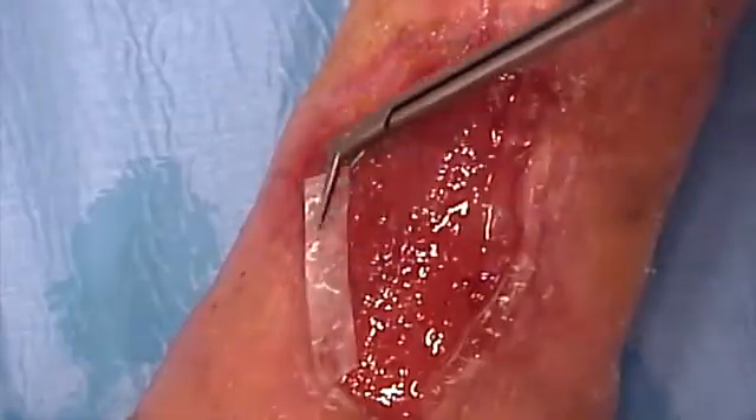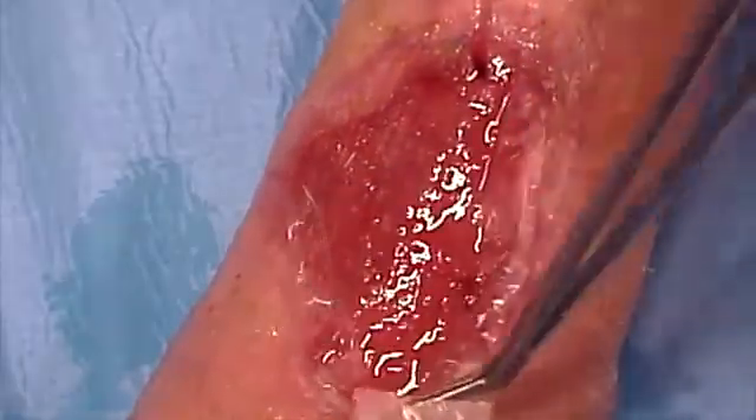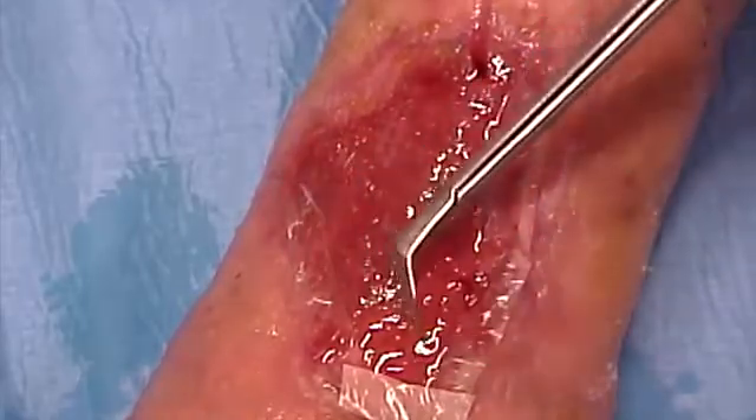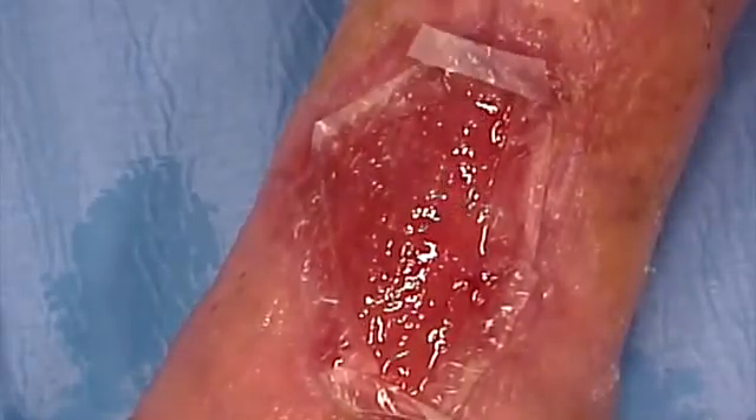The Genix EGI membrane, like the Genix IT membrane, is obtained from animal pericardium and is made up of 98% type 1 collagen. After special processing, it is thinned and shaped into sheets of a thickness varying between 200 and 400 micrometers.